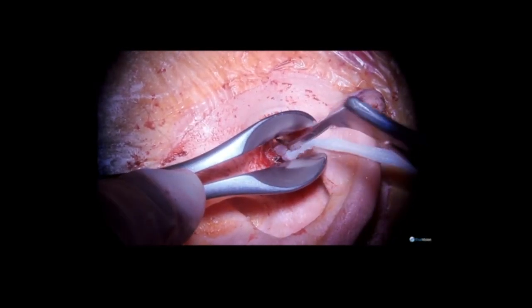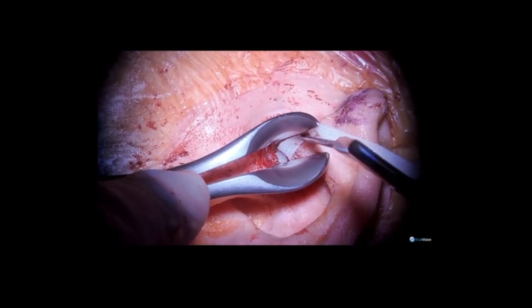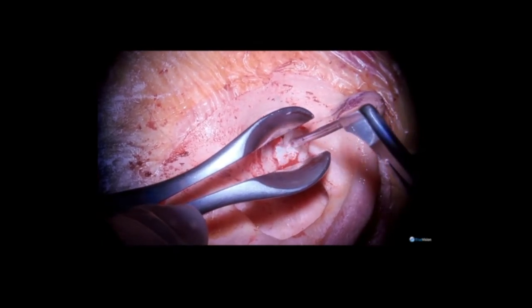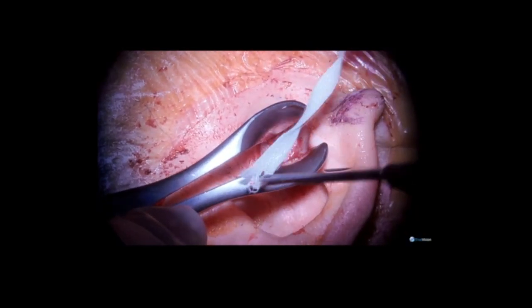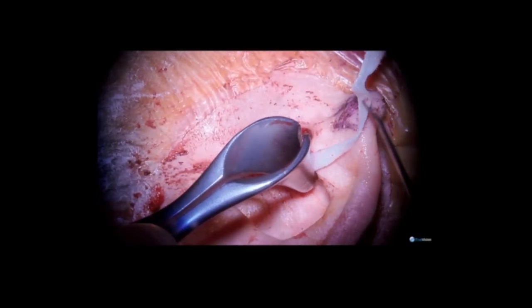Using a nasal speculum, I introduce a number of strips of antibiotic-soaked umbilical tape to support the reconstruction and to optimize the diameter of the external auditory canal during healing.